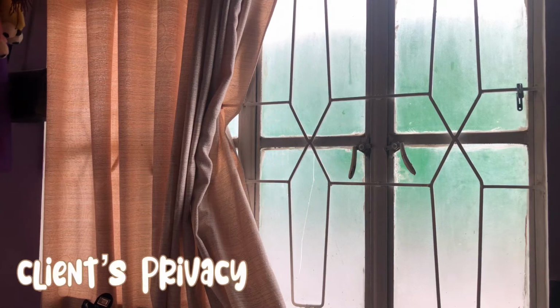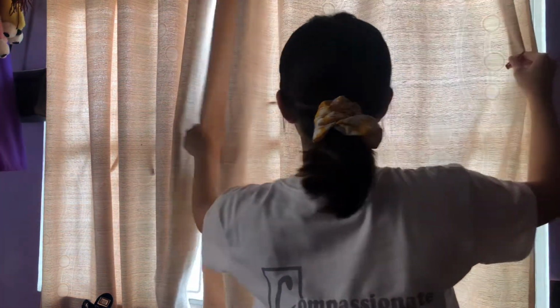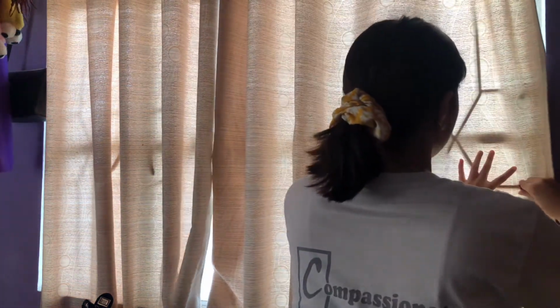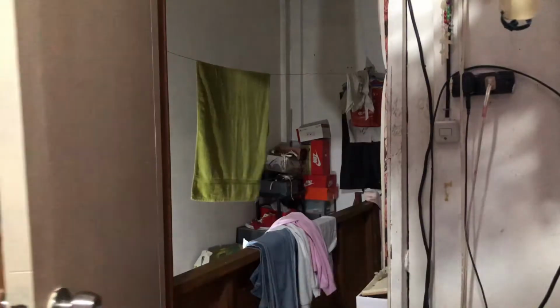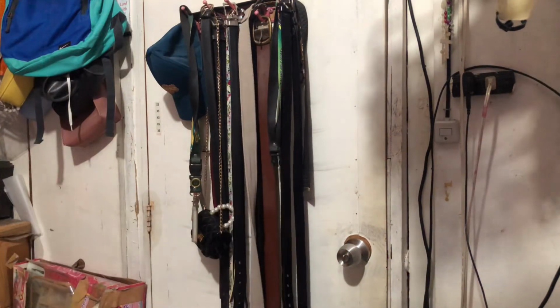Provide for client's privacy by closing the curtains and door. Set up the intravenous equipment with new container and label it.